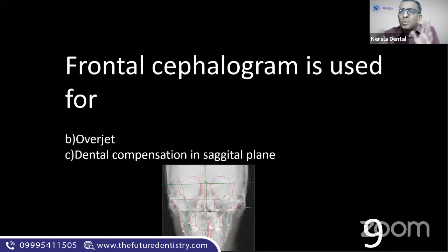Sagittal. Guys, those who are not very familiar with these terminologies called sagittal, let me tell you one simple point here. Sagittal, side. S, side. Side means lateral cephalogram. Letter S is sagittal, is side.